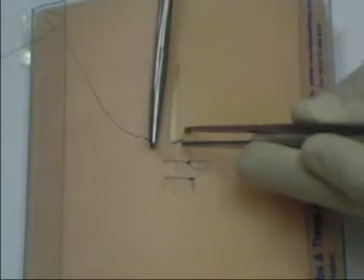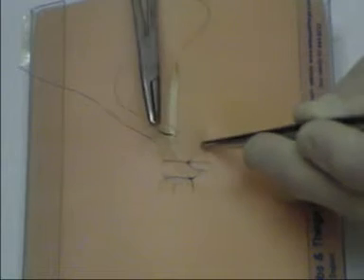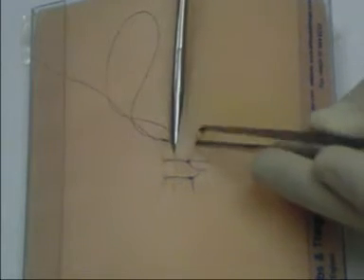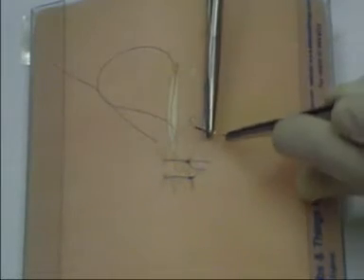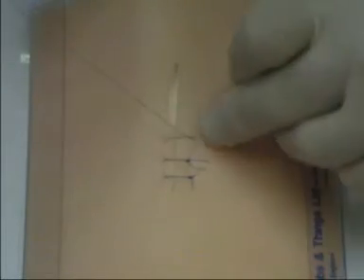In simple skin suturing, the needle is inserted vertically, emerging at the deepest point of the wound. It is then placed deeply to emerge through the skin symmetrically with the first side. Monofilament nylon is often used.